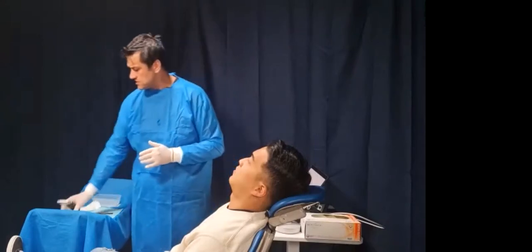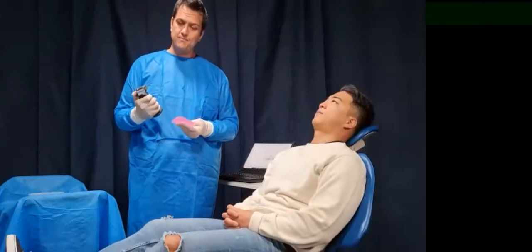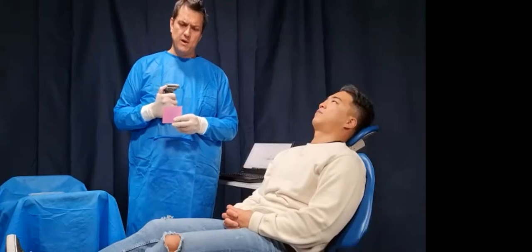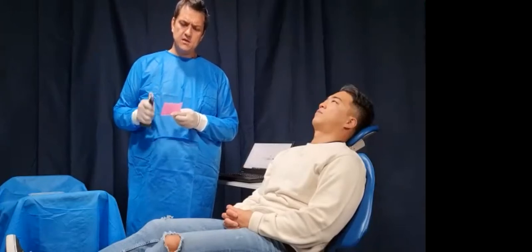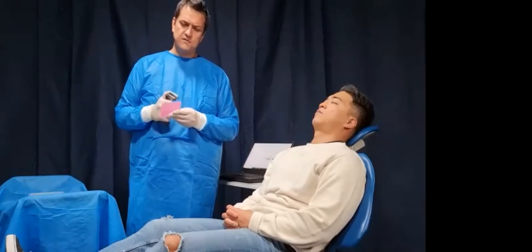So first things first, grab your sheet of wax, and with your sheet of wax, it's pretty easy. Just grab your brush flame. Now, we don't want to make it drippy wet, your wax. You just want to get a nice even heat, even coverage. Now, this is your first stage.